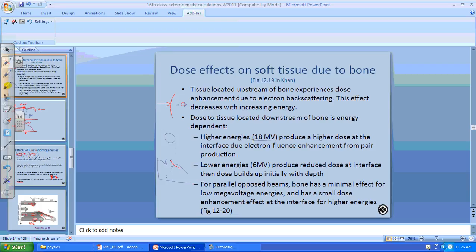Because if you assign the whole thing to body, the assignment that you've given supersedes all the Hounsfield units. Okay, so if you assign the whole body, so every pixel in there is now water, and then the actual metal parts have been assigned to whatever Hounsfield unit, then there's really only 2 Hounsfield units the algorithm is going to consider. Okay, and then anytime you draw a structure, by the way, the default density for that structure is water. And then, hopefully that's a little more accurate than considering all the streaked artifacts and using pixel by pixel data with those streaked artifacts. Okay.